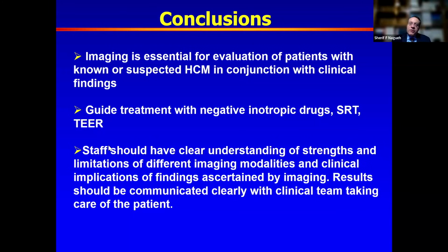The practical thing that I've noticed is that in some patients, when you do the serial echocardiograms, you can see a subtle drop in EF, and perhaps that should be factored into dosing these cases, so you do not wait till it hits the 50% or lower cutoff before you do something with the drug dose.